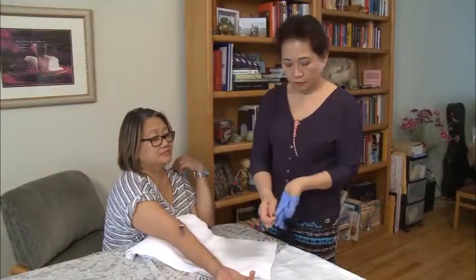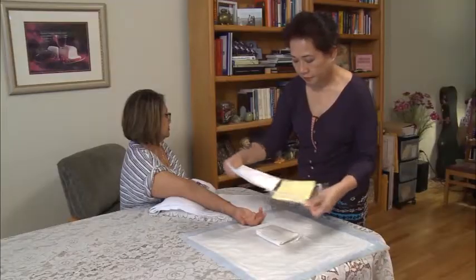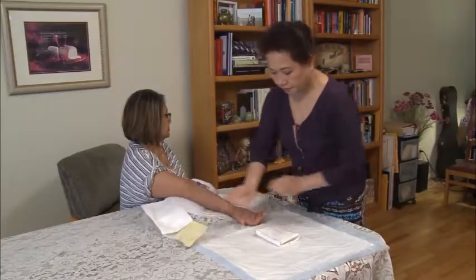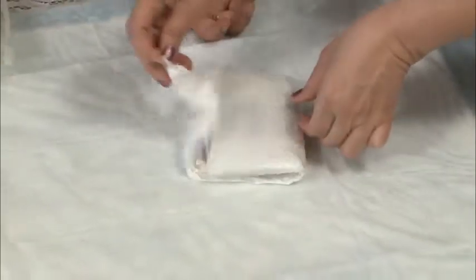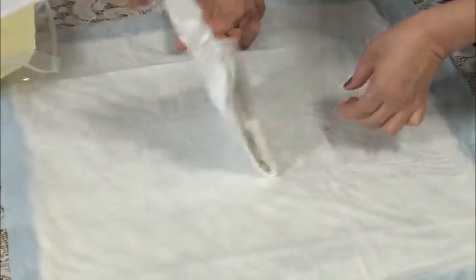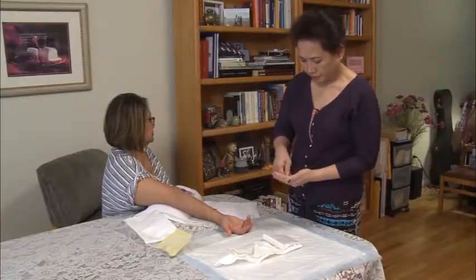Remove the clean gloves. Peel the package open. Place the plastic package to the side. You can use this to hold trash. Touching only the outside corner of the wrapper, open it away from you first. Use the antiseptic hand gel provided in the dressing kit.